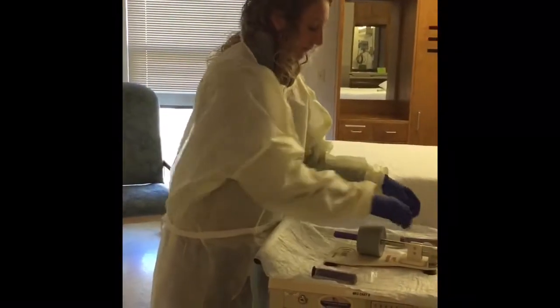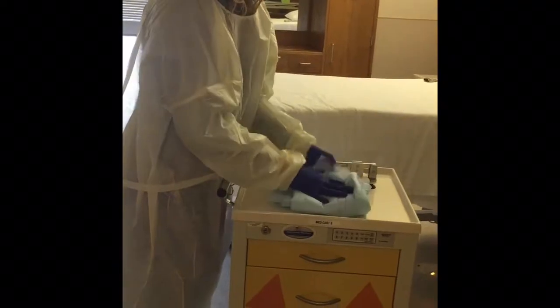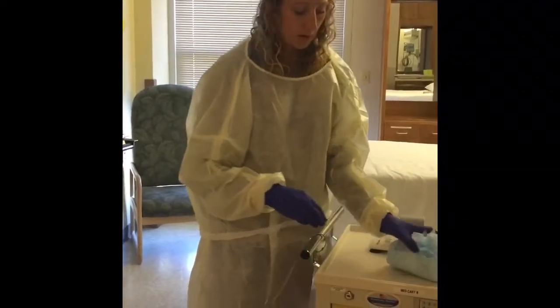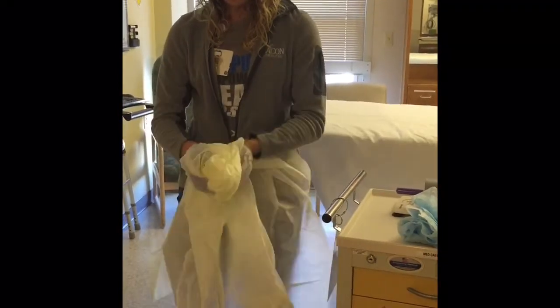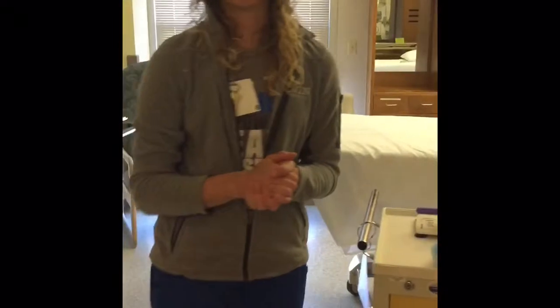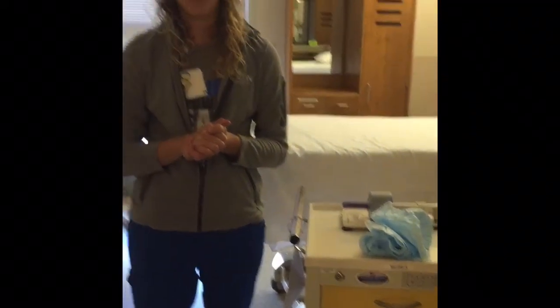And then once I'm done with administering my medications, I'm going to ball up all of my hazardous med supplies that I used for medication crushing and administration, aside from the RX Crush. All the other supplies I use will go into the black bin in the medication room. Your PPE, you can take off, and that goes just in the regular trash. And then you would want to perform hand hygiene with soap and water after handling hazardous meds. The cart itself and the RX Crush would then need to be wiped down with a bleach wipe. And that's that.